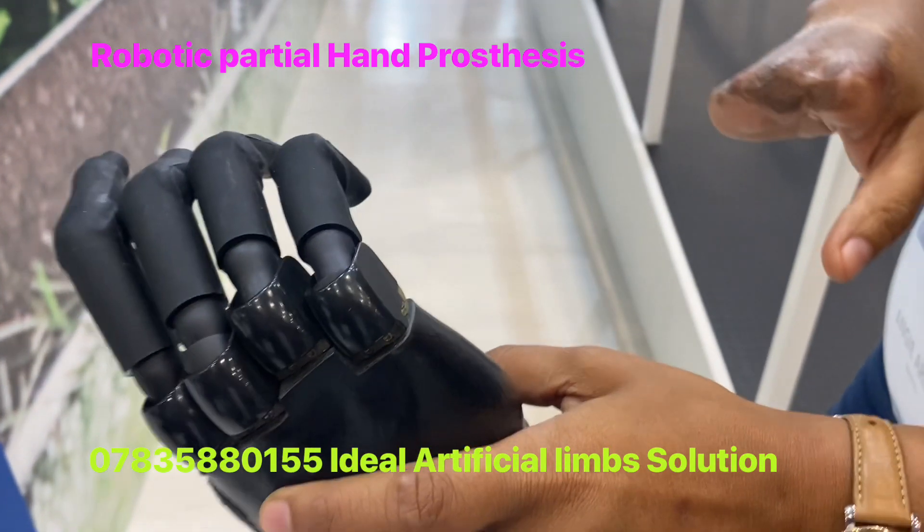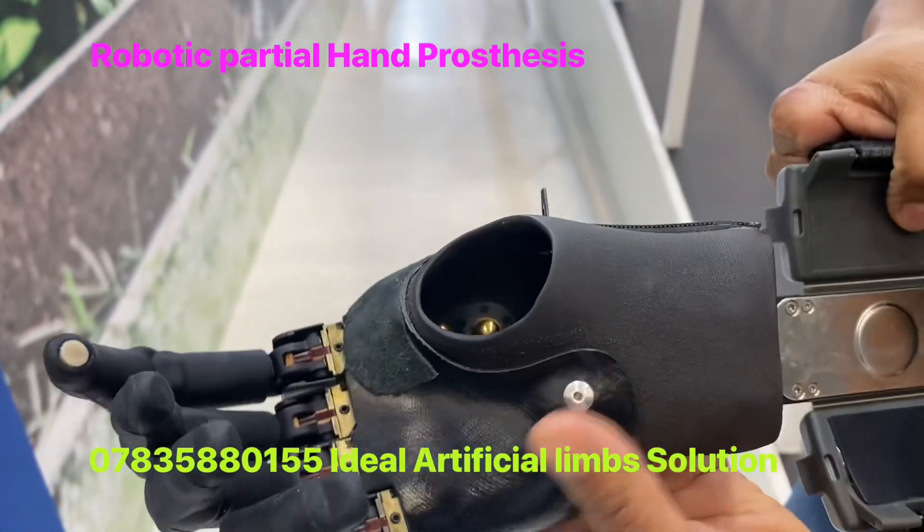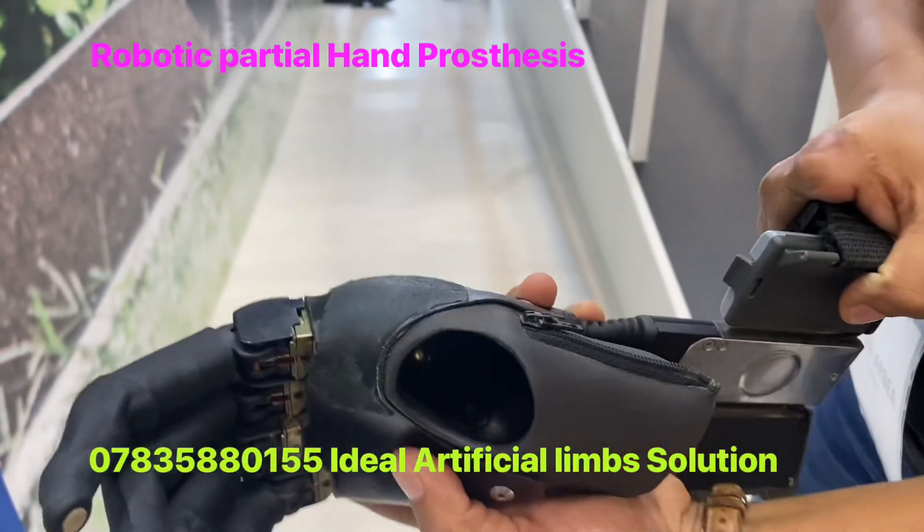Welcome to Ideal Artificial. This is from Össur, the new hand. This is called i-Digits Quantum.